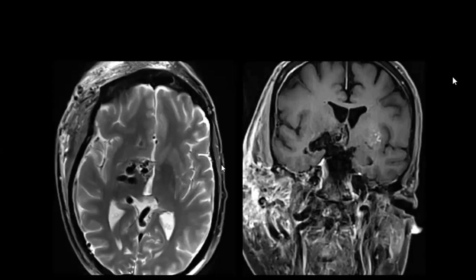There is also a loss of signal on the same side. Hyperintense signals are also noted on the right side on the T1 weighted images in the white matter. The filling defects are most probably dilated vessels.